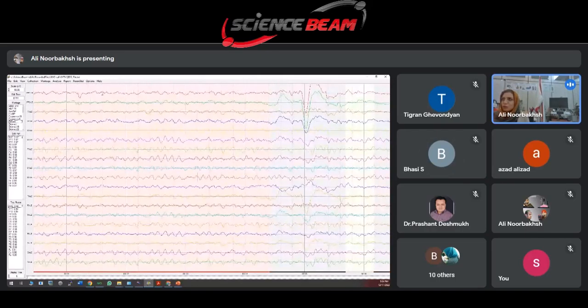After that, we should go to report and generate analysis. And we can see interpretation. We cannot see this page.